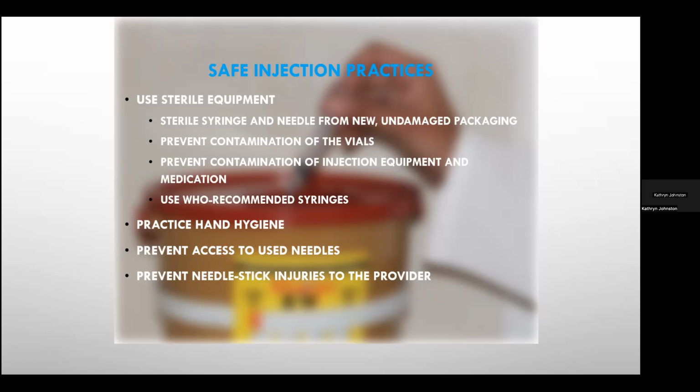So it's important that if you are participating in phlebotomy practices and you don't know the patient, or there's a risk that the patient is going to jerk or move, then you should have someone assist you, because what can happen is that if a patient has a sudden movement during that phlebotomy practice or during that specimen collection, and you're using a needle and syringe, then it is possible that you as a healthcare worker can become accidentally injured with the needle.